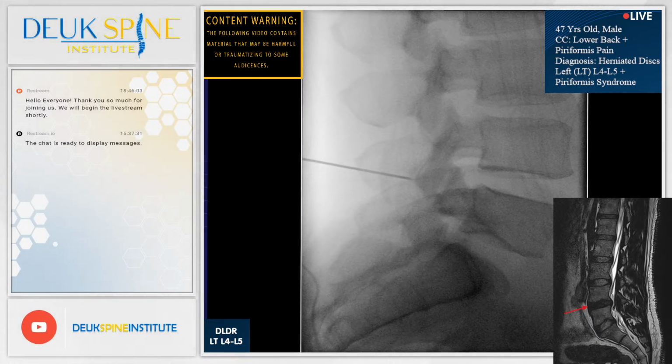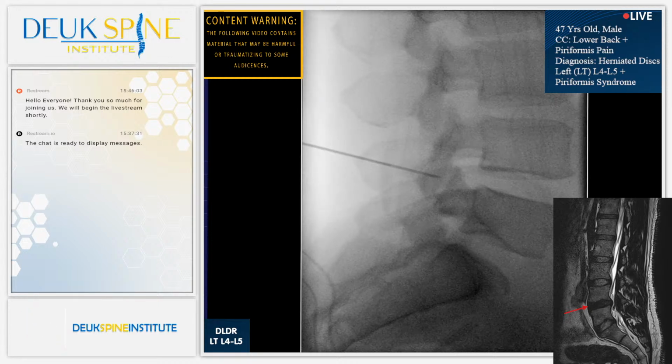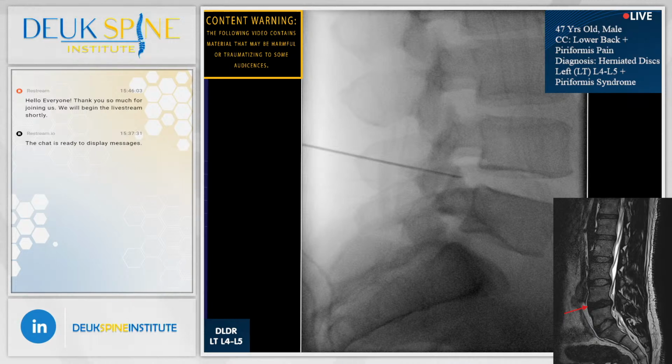I want to start just a little bit more lateral now. By the way, every patient's slightly different, okay? There are so many things that vary. The pedicle distance varies, the intervertebral distance varies, the height of the disc varies, the size of the facets vary, the facet capsule varies, but in the end, the problem with the disc is always the same.